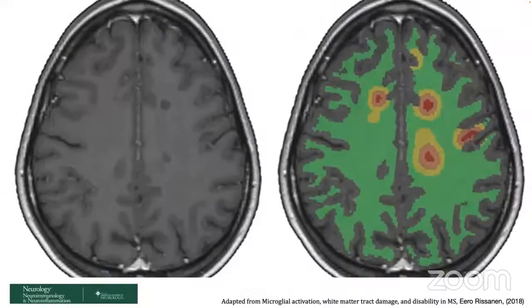And I've pictured a couple of scans to show you how it can be imagined from a microstructural level. The integrity of the axons and the myelin is highly abnormal in the lesion, with a gradient surrounding the lesion as well.